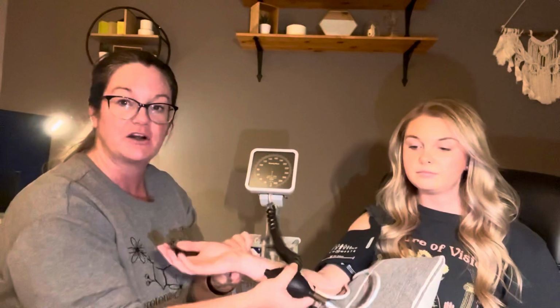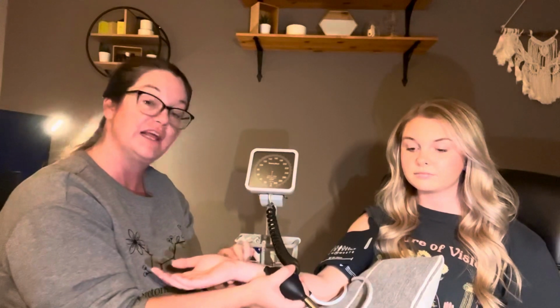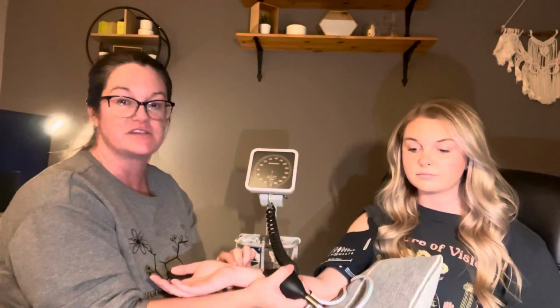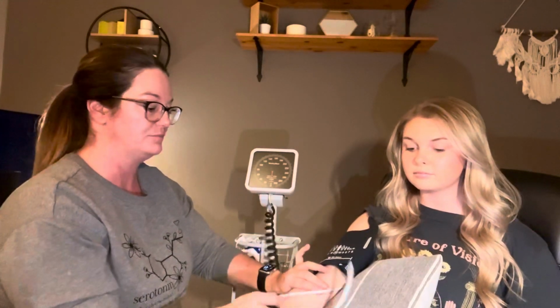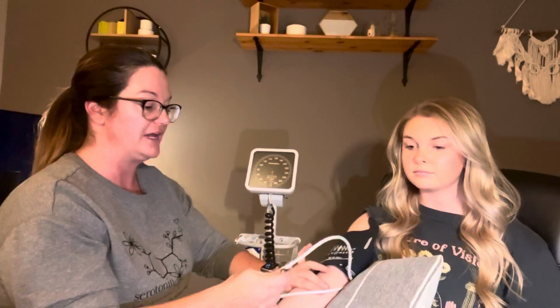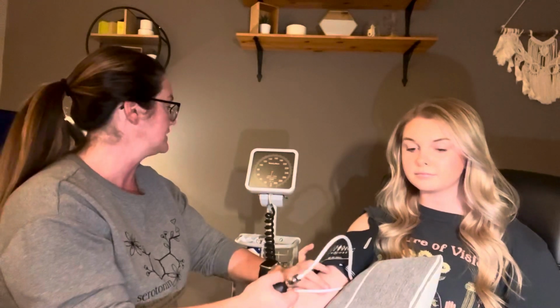I want you to try there, but if you can't find it, don't pretend like you can feel it. You can come down here and go to a radial pulse and inflate the cuff until you can no longer feel it and go 30 millimeters of mercury higher, okay? So try with the brachial, but if you have to use the radial, that's okay too. So I can feel her brachial pulse. My valve is closed and I'm gonna start to inflate the cuff until I can no longer feel it.